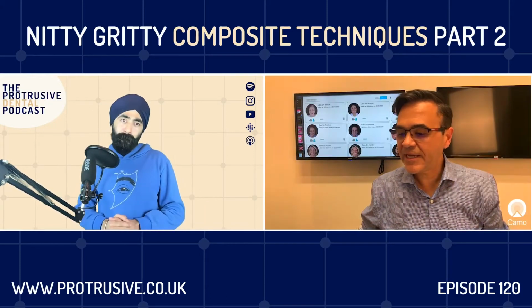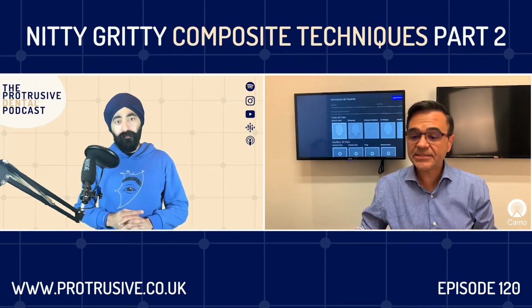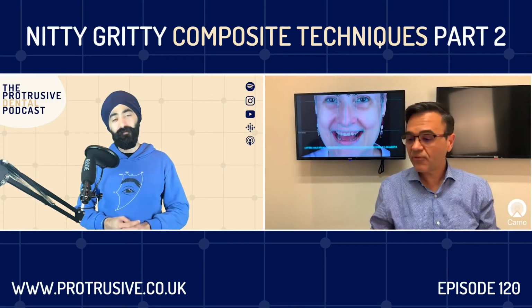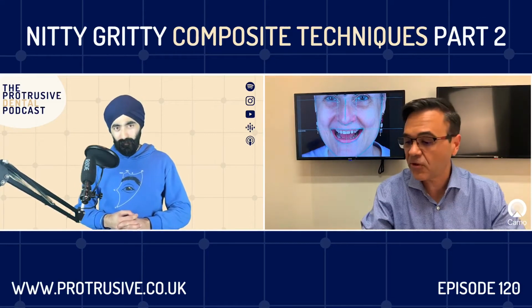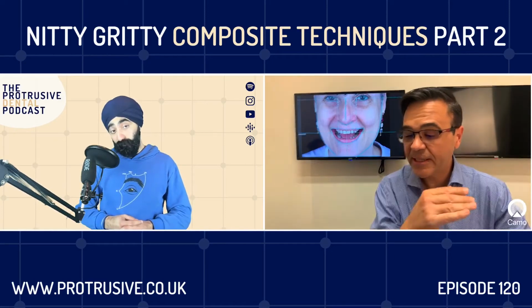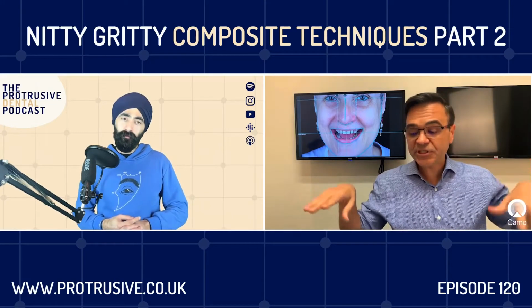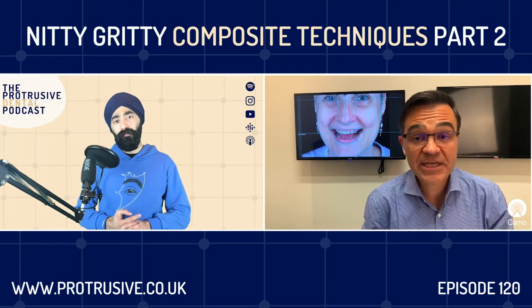Oh, sure. Whenever I have a case, I do digital DSD, and the DSD is just a great way to make sure that your patient, first of all, sees what they need, and also it's a great tool for your lab technician. As you can see here, I have this app which is called Smile Design Pro, which I use every day. It gives me the plane of occlusion and compares it with the bipupillary line. So I show this to my lab technician, and this gives me the anterior tilting position of my smile compared to my patient's eyes, which is the static part that you need a Facebow for.